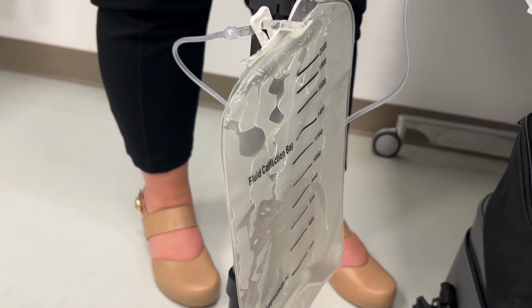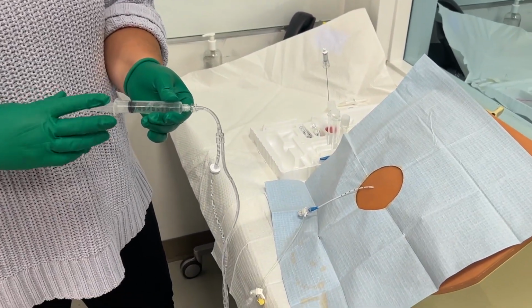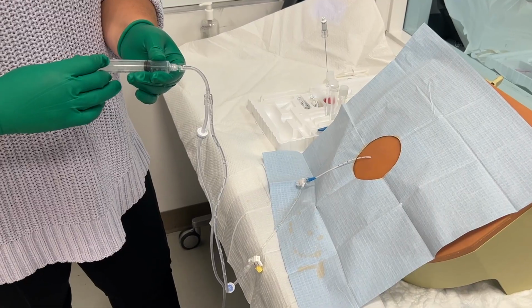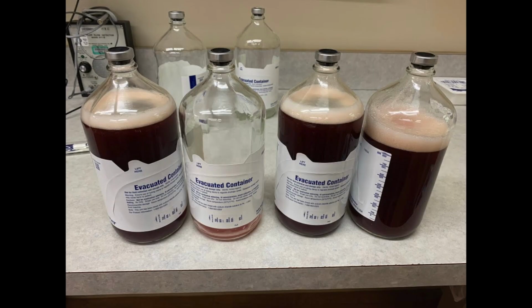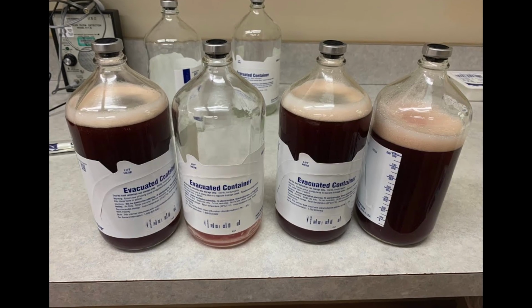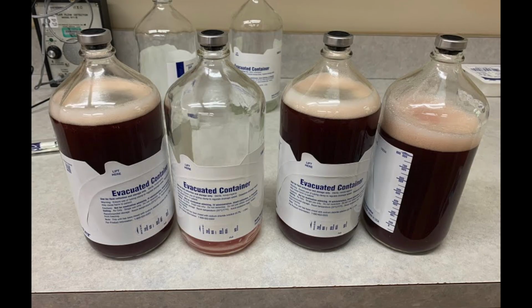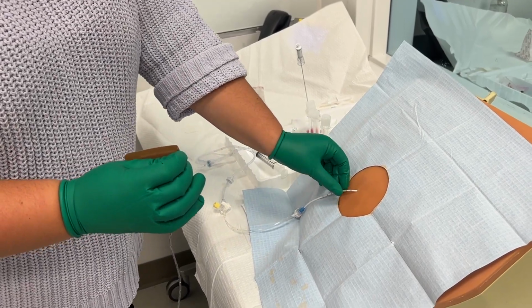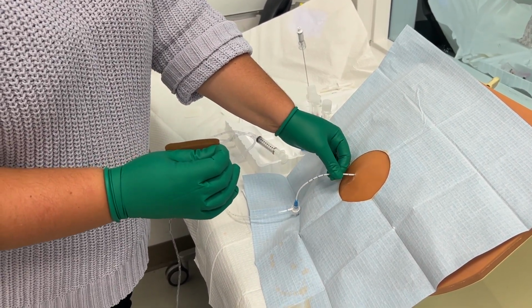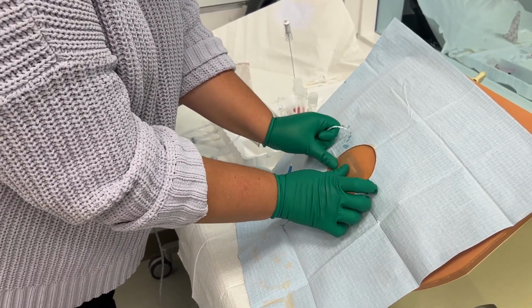You can continue pulling fluid out using the syringe and pushing it into the collection bag until you have your desired amount of fluid. If your facility has these vacuum collection bottles available, you won't need to use the aspiration method and the fluid should flow spontaneously like with a blood culture bottle. Last but not least, we can use gentle traction to remove the catheter and cover it with a bandage.